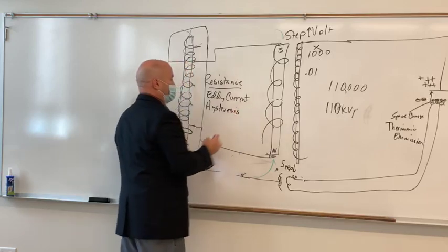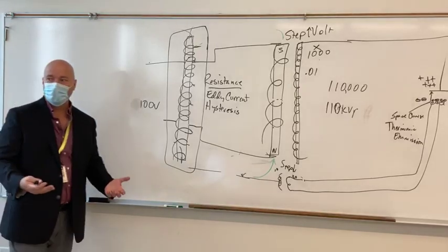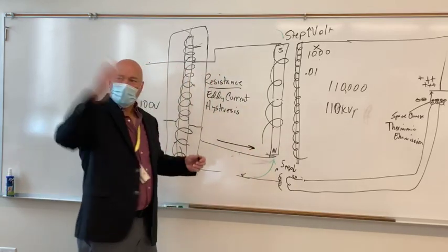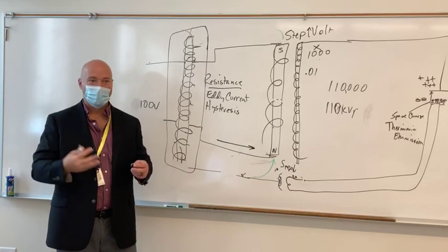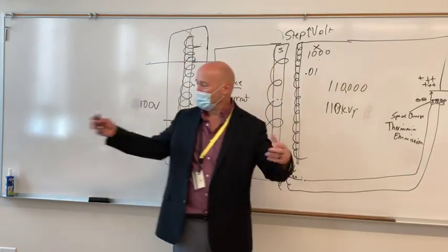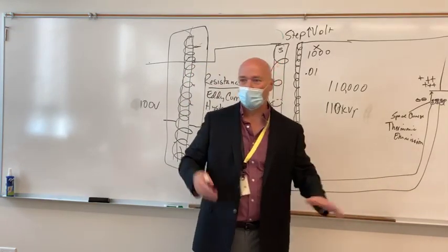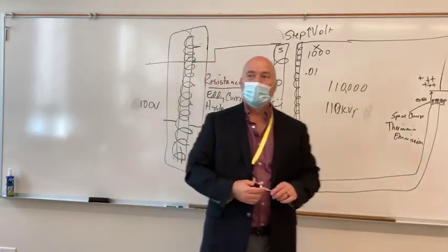Hysteresis. And hysteresis, you can look it up and it gets kind of complicated, but in effect what it is is because electrons are going that way. Anybody ever played basketball? Okay, running the lines. You know what running the lines is, right? If you don't, then you've never played basketball or you've had a horrible coach. So running the lines, what you did was, there's lines on the floor of the gym, and what you have to do is you have to run out, bend down, touch one, run back, touch, run to the next line, touch, run back and touch, and so forth.